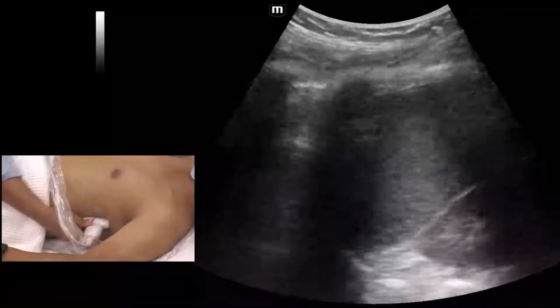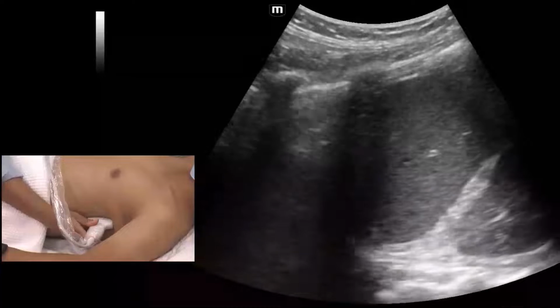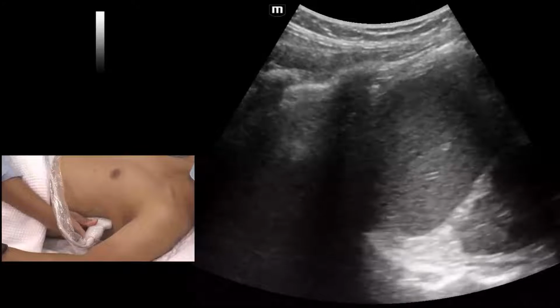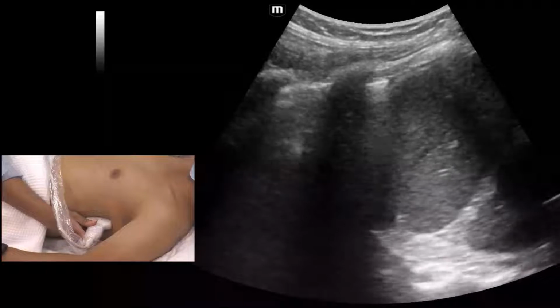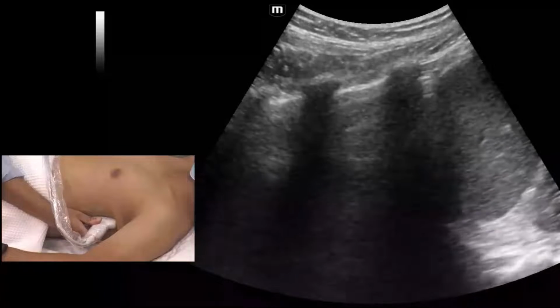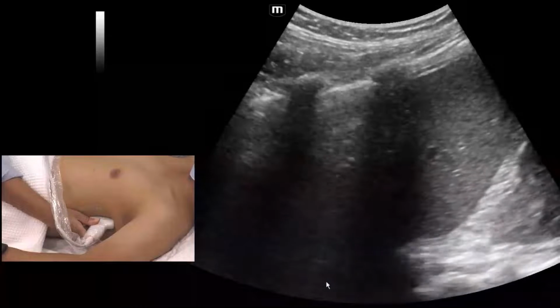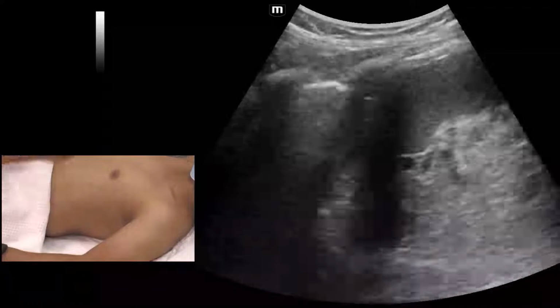just above the diaphragm. This is important to appreciate, particularly if we are dealing with consolidations, because consolidations can be hepatized in nature, and as we examine the lung with ultrasound, you want to know whether the hepatization is the hepatized lung or a solid organ intraperitoneally. If you move further up, you can see there may be one or two beams, if you can appreciate here. Yeah, it goes all the way down. Again, it is pathological when it's 3 or more in a particular intercostal space.